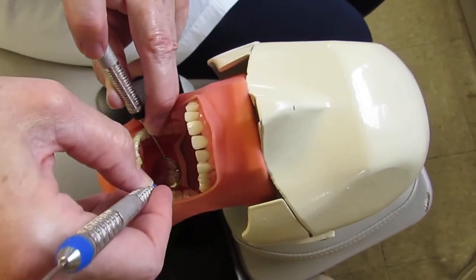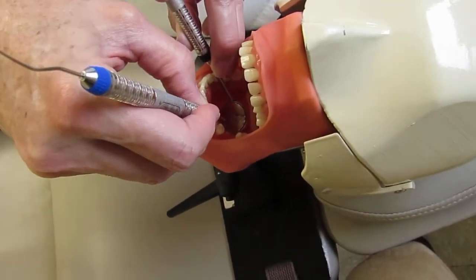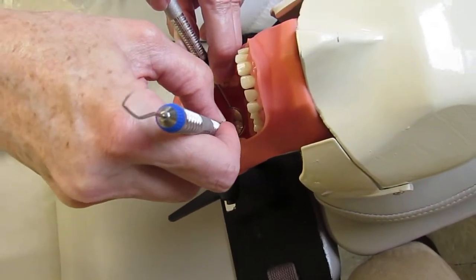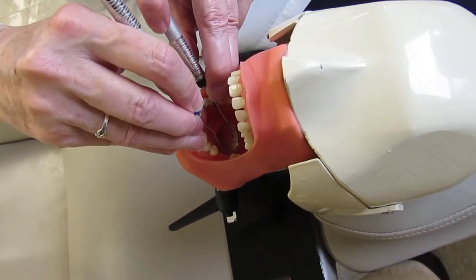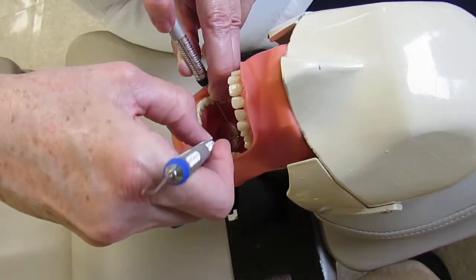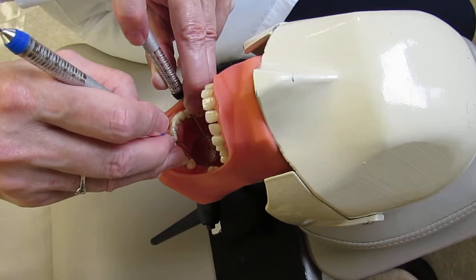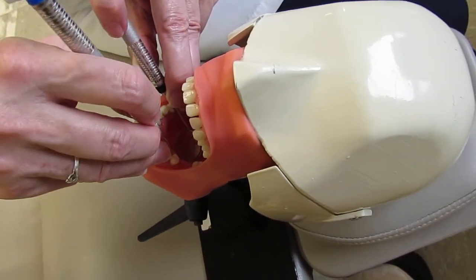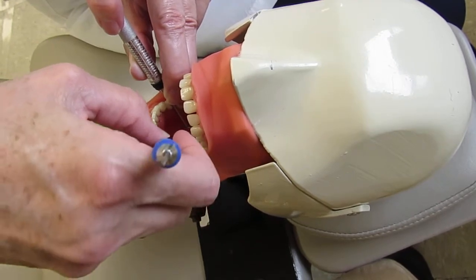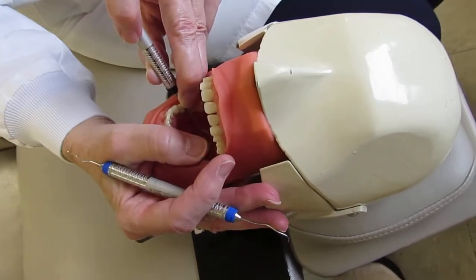Continue to the next tooth — same thing: get ready zone, close so you can sneak the tip into the sulcus, rolling, coming across. Exploring requires a lot of pivoting — pivoting and walking and rolling all at the same time. That completes the left side posterior sextants; go through the same process for the right side.